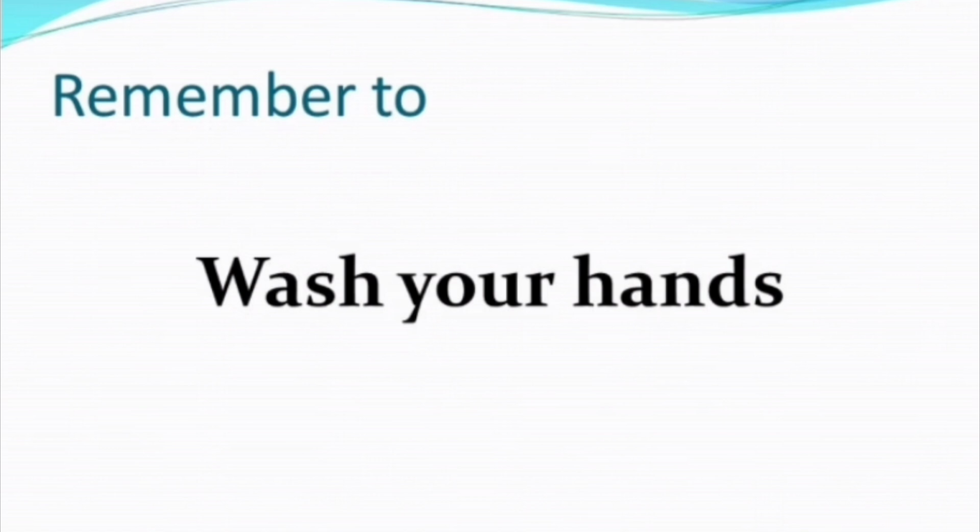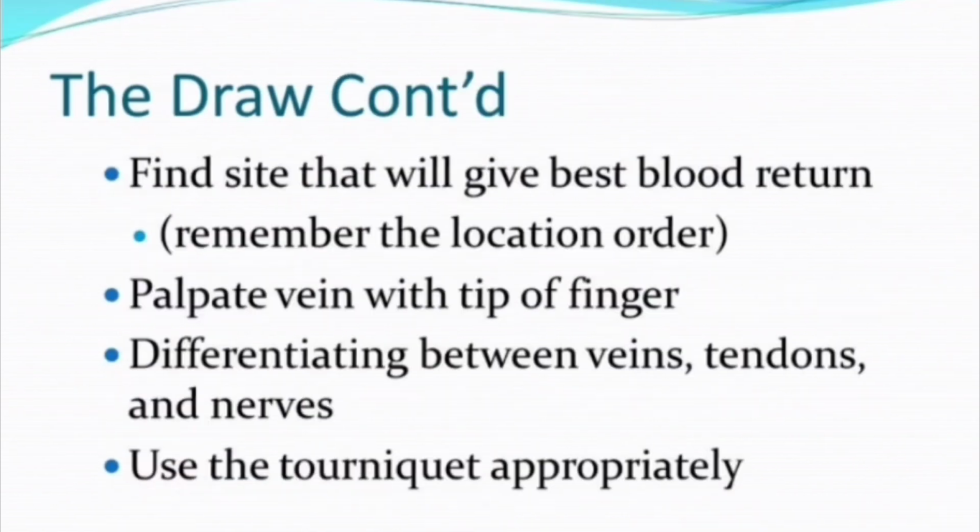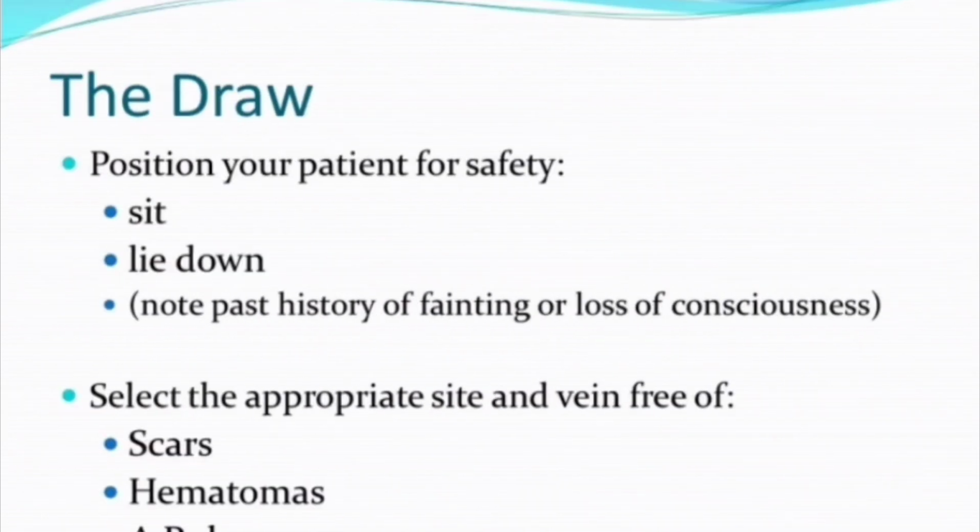In today's class, I discuss venipuncture techniques. The next step is to wash your hands. To draw the blood, position your patient for safety. Sit down, lie down. Note the past history of fainting or loss of consciousness.